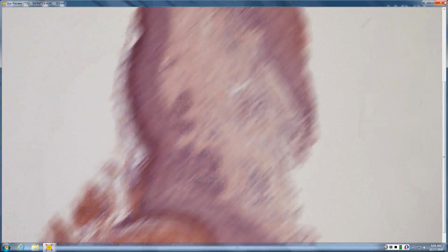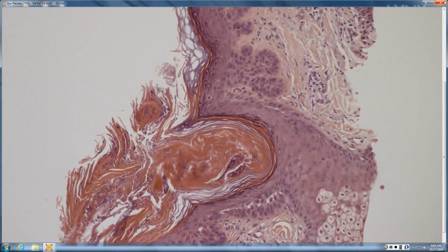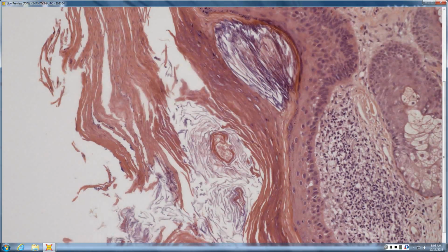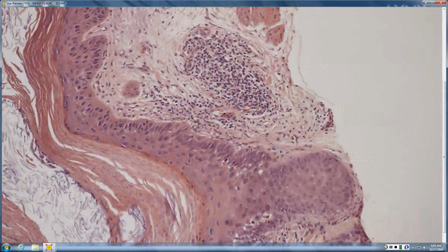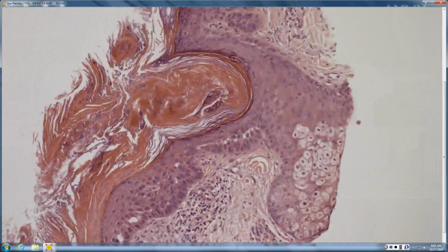AKs tend to arise from the basal layer. They often bud downward. They tend to run along the outside of follicles, whereas Bowen's replaces the entire follicle. They often have a red and blue horn with the compact parakeratotic horn interrupted by columns of blue lamellar stratum corneum, which arise from the hair follicles, which remain intact. It's usually not quite full thickness. The epidermis matures at the top, but the bottom is atypical, and then you've got acantholysis.